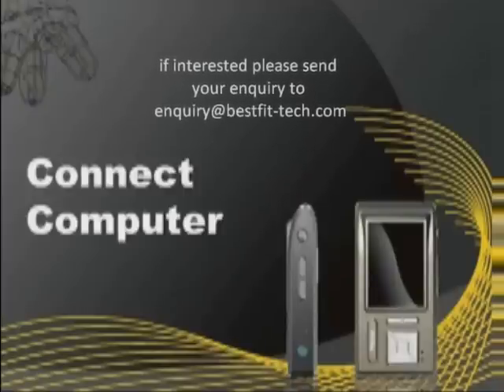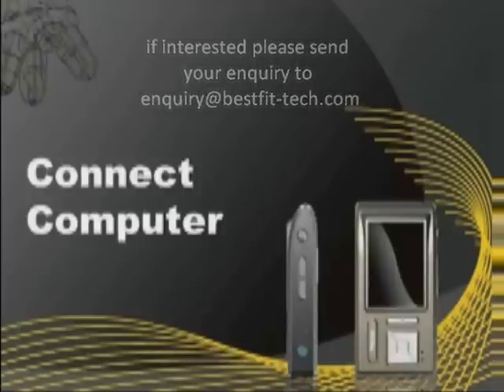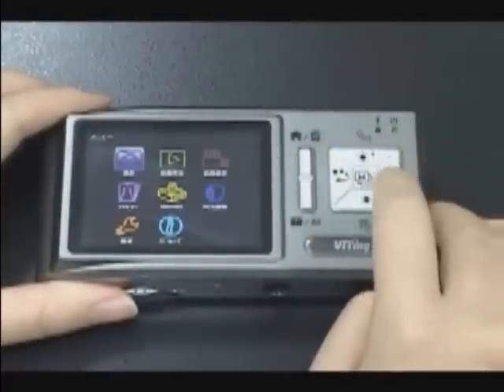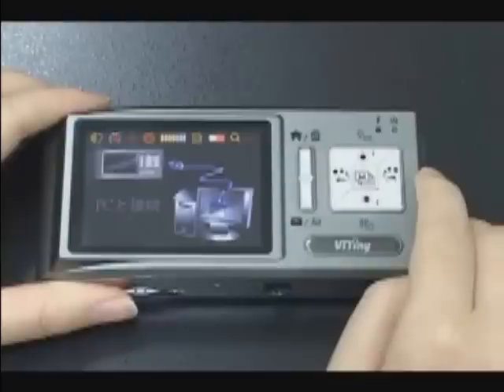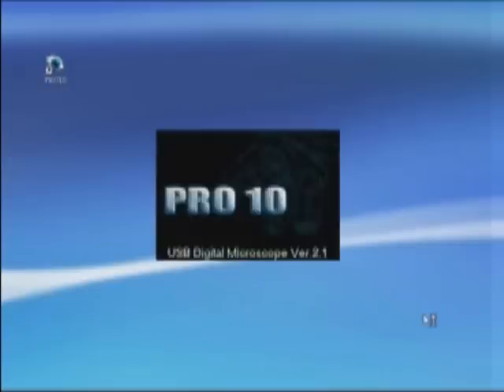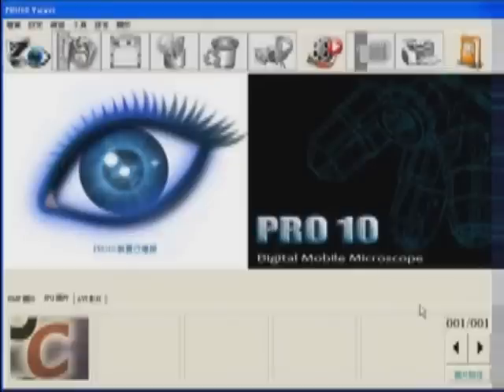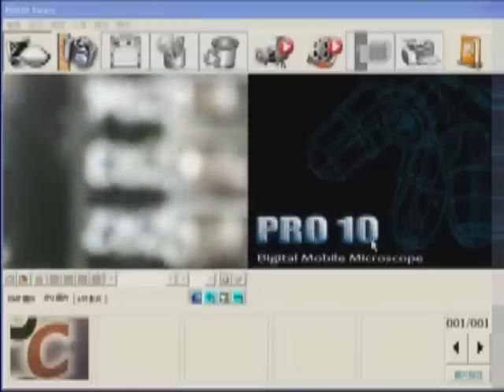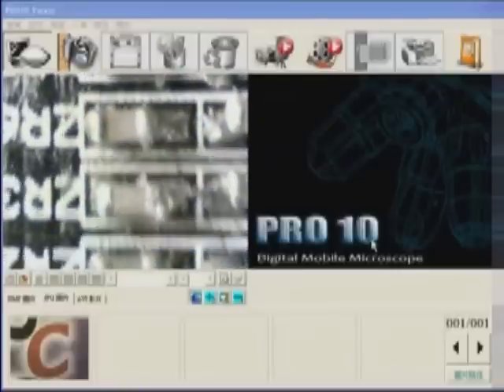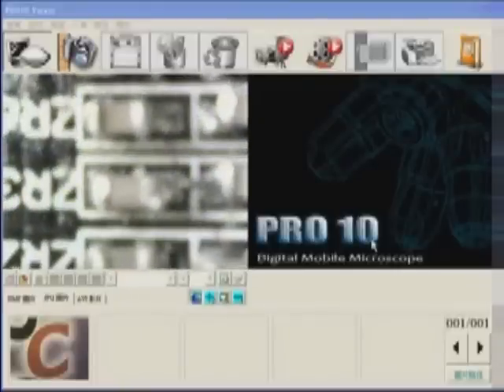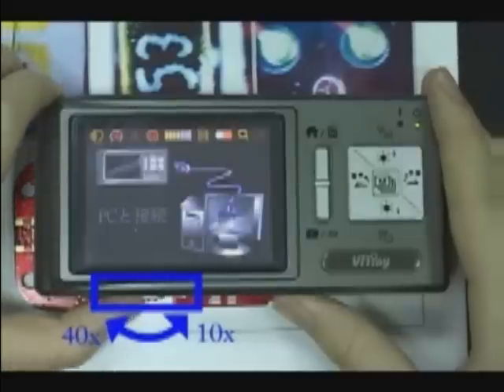Connect to computer. Plug in the USB cable, enter the menu, and choose PC Cam. Press the middle button to connect the Pro 10 to the PC. You can adjust magnification under PC Cam mode. At the moment, the effective magnification is optical 10 times and 40 times only.